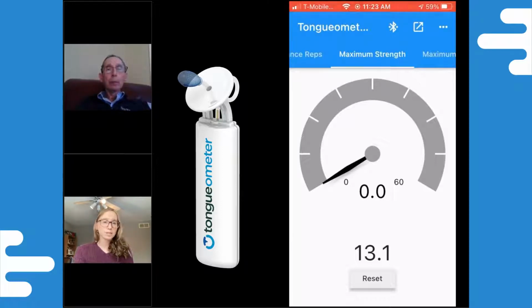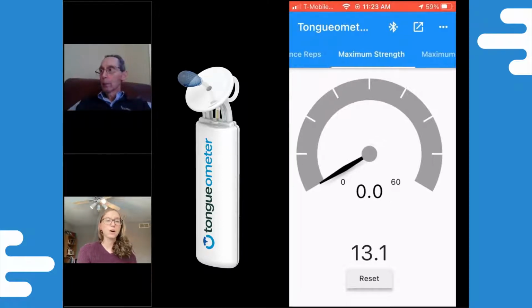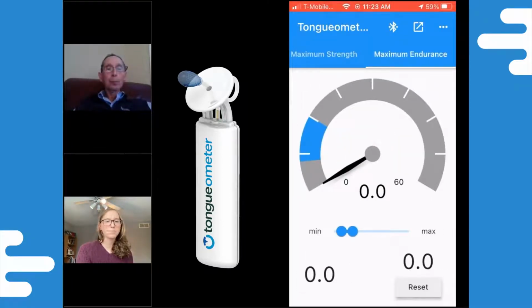So once you assess somebody's maximum strength, you might want to assess their maximum endurance. So how long can they maintain that pressure for? So to do that, you swipe over to the next module here, which says maximum endurance. And then you can set that target range, that blue highlighted section. And you might want to set that around 50% of somebody's maximum strength. This is patient specific, based on your clinical judgment, whatever you think is best for that patient.